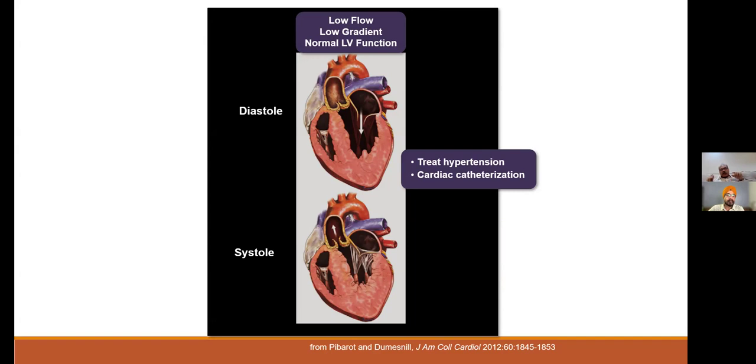Second is hypertension. With higher hypertension, the equalization of LV systolic pressure and aortic systolic pressure is lesser, and that's the reason you underestimate aortic stenosis. Third is that, say prior, the ejection fraction was 70%. Now it is 55%. So this will manifest as low flow, low gradient, poor LV, because compared to the 70%, this is a poorer LV. These are all hypotheses, but yes, this condition exists.